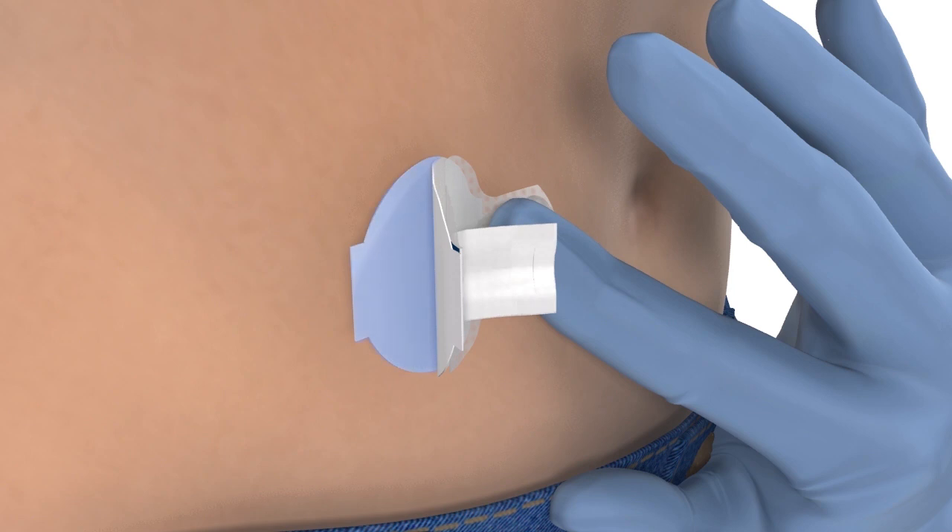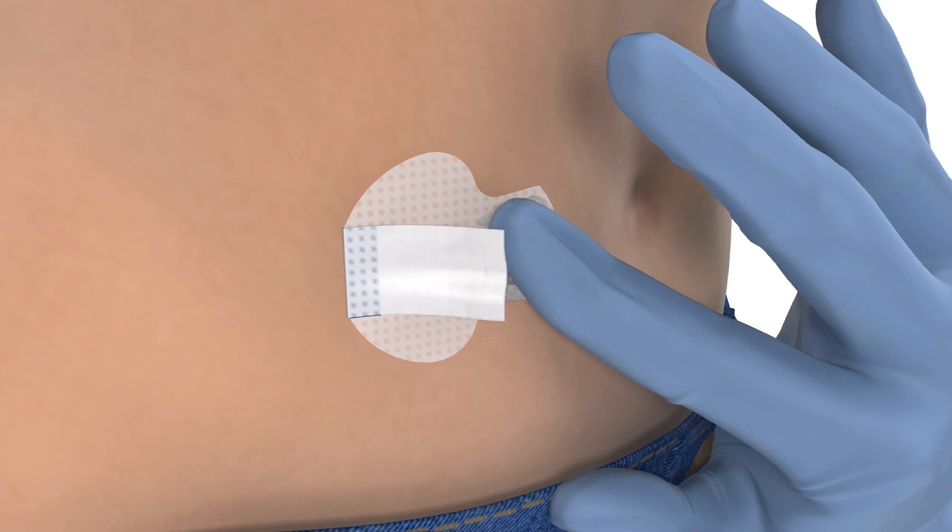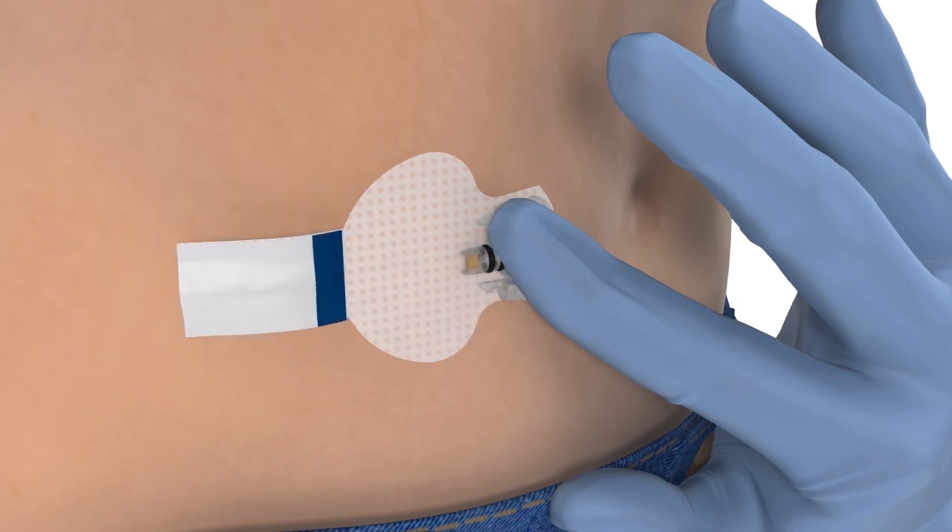Remove the paper backing from under the adhesive pad and press the adhesive against the skin. Now flip the tab so that it lies flat against the skin, but do not remove the paper backing just yet.